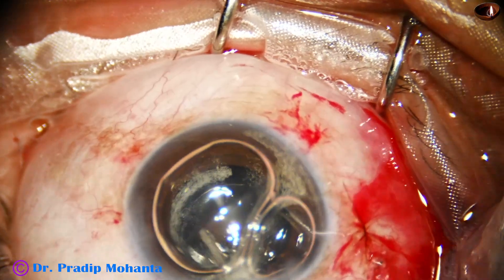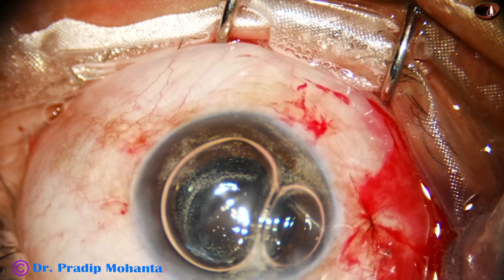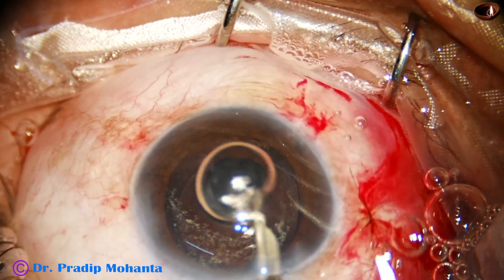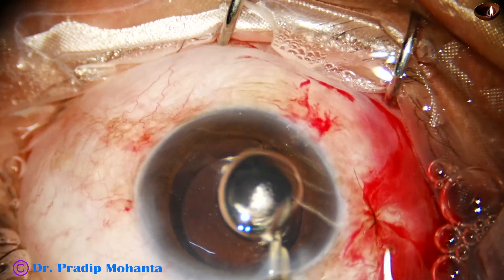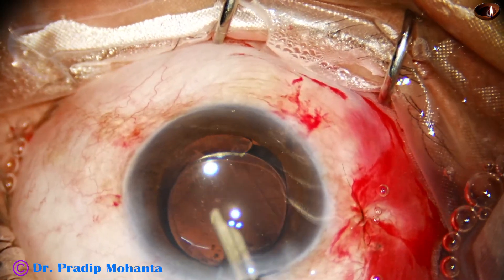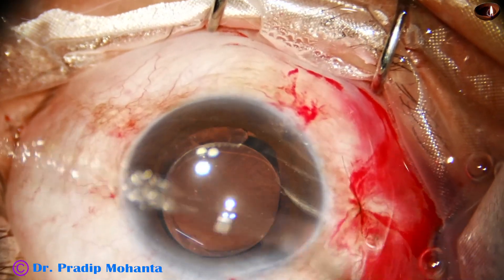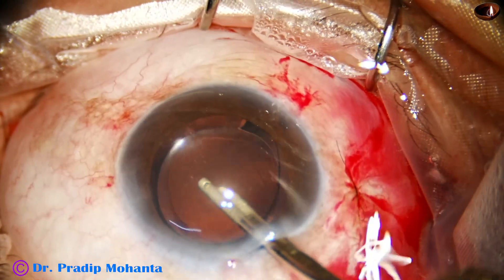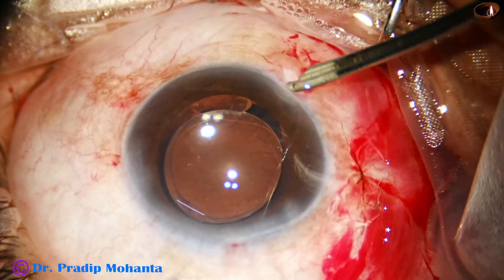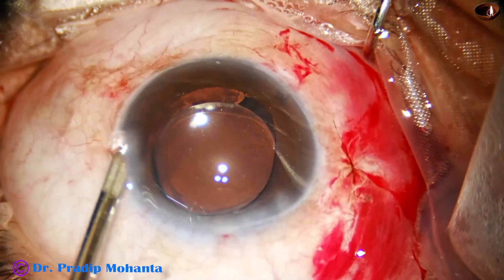Some additional work in the anterior chamber to finally check if there is vitreous remaining. At this time, I need not go through the pars plana — if it is there, I will manage it through the limbal wounds. I see that there are no vitreous strands in the anterior chamber, so the case is managed. This is an edited video; the initial surgery took about 28 minutes, edited to 12 minutes to give you an idea of how to do pars plana anterior vitrectomy.